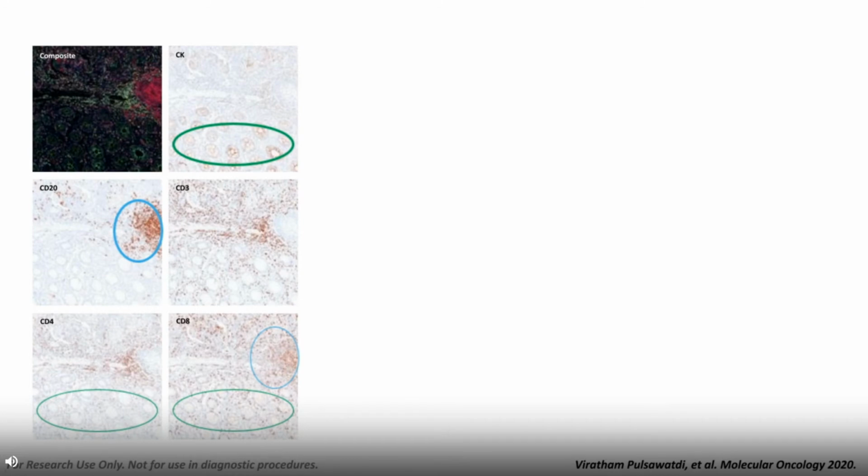And with the cytokeratin, we were able to change around the antibody order that has been applied. These fluorophores are much more sensitive to the DAB reaction products. So even though something looks as though it might be a good fit by the initial DAB assessment, whenever you start to pair it with the fluorophores, you may see it's more sensitive than previously anticipated.